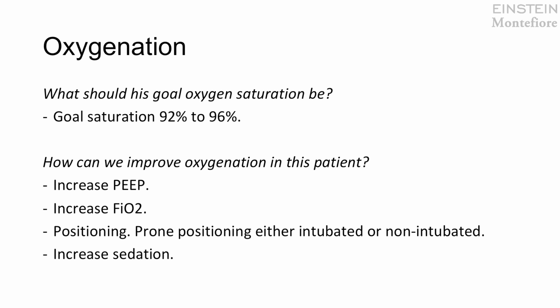The other thing to do if a patient is not synchronous with the ventilator and they're intubated is to increase sedation. This doesn't always work, but sometimes serves to improve oxygenation. If you're able, you can additionally attempt to administer paralysis, though this might not be within the scope of care for a patient outside of the ICU.